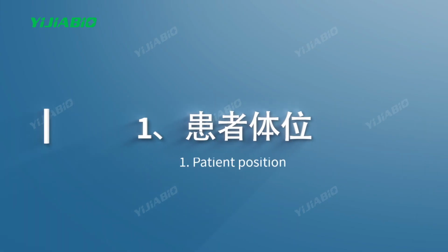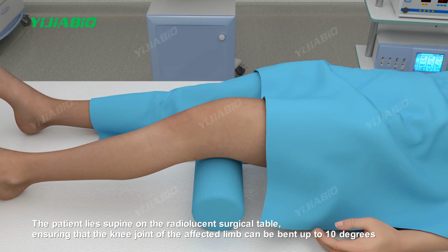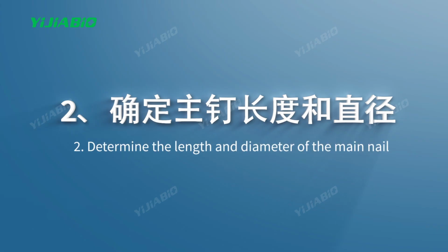One, patient position. The patient lies supine on the radiolucent surgical table, ensuring that the knee joint of the affected limb can be bent up to 10 degrees. Two, determine the length and diameter of the main nail.